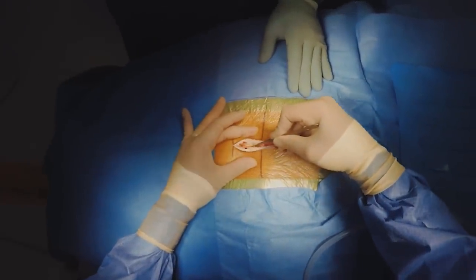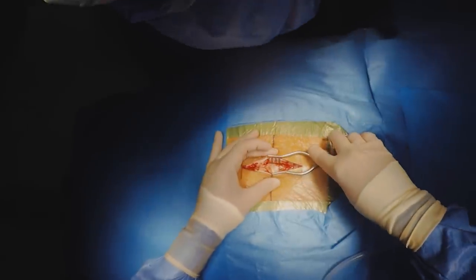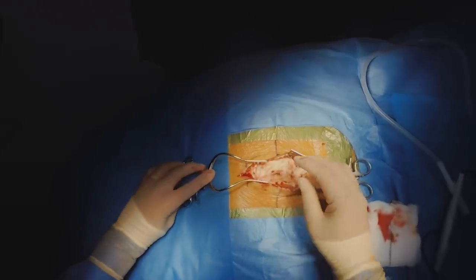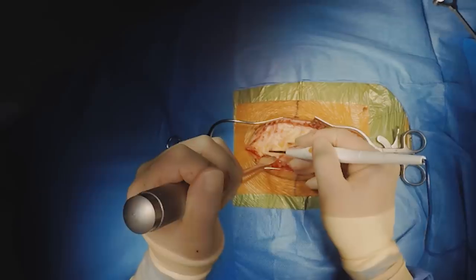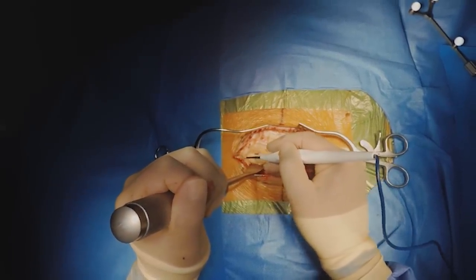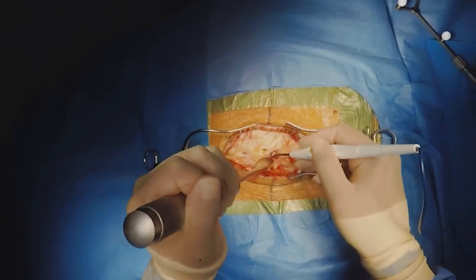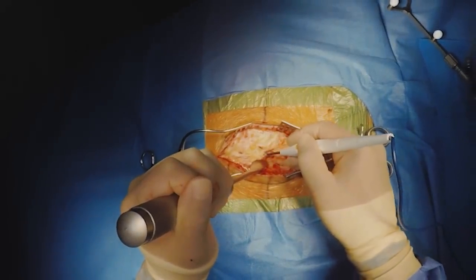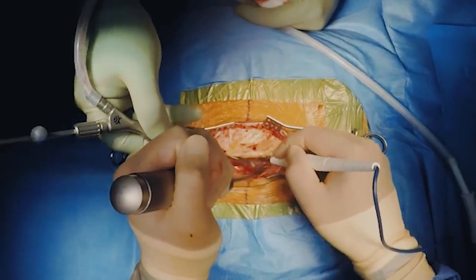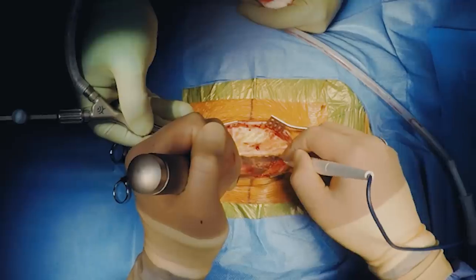So we make the initial cut that goes through the skin and the fat that's just underneath it. Next we need to spread the skin apart to give us some better access to the tissues underneath. After this we're going to use this white instrument called a monopolar which burns and cuts through tissue and seals off any bleeding arteries at the same time. This helps give us a nice clean dissection through the muscles and stops it being very bloody which will obscure what we're trying to see.